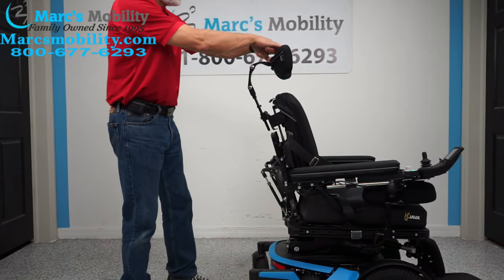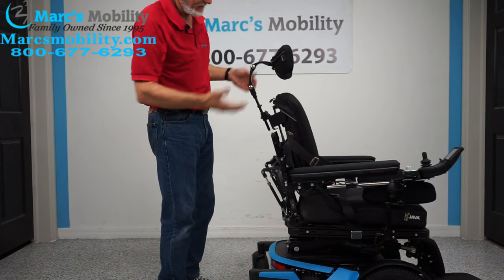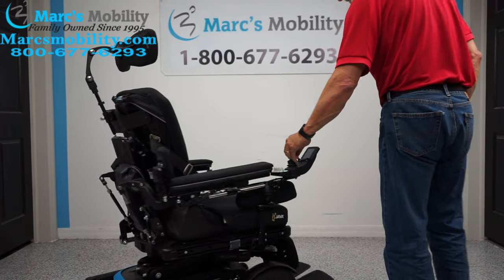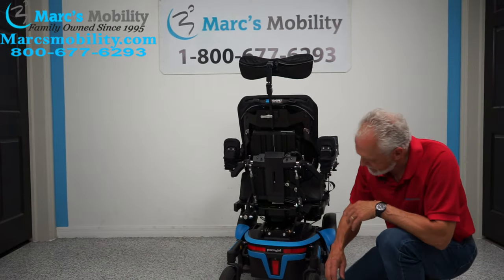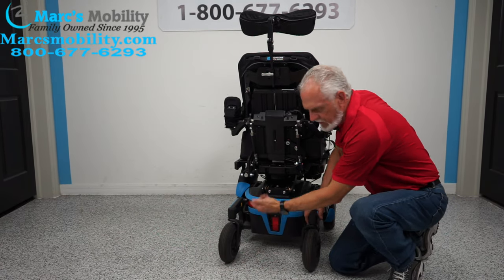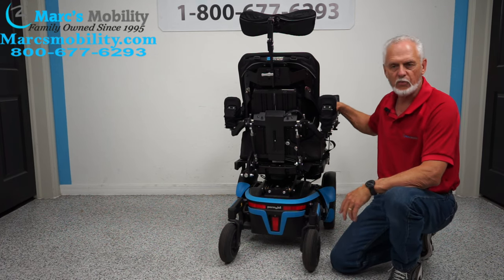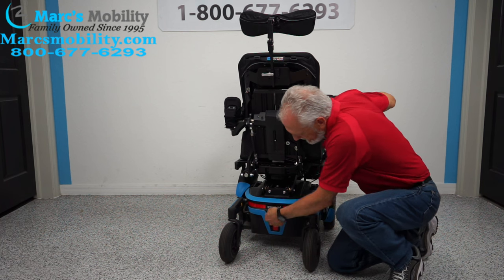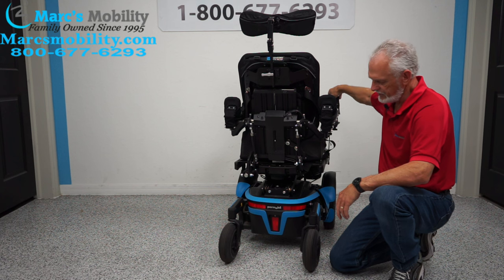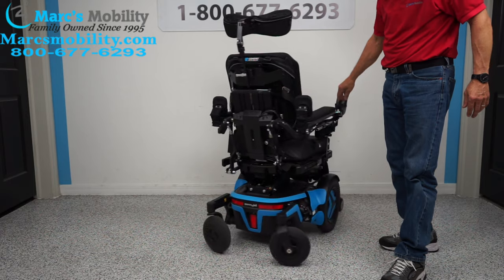The headrest is adjustable here but it's also fully adjustable forward, backward, up and down. When we ship these chairs, we turn the power off. Right in here there's a reflector — inside of here you'll see it. I just turned the power off. When you get your chair, go right here, flip the switch — there we go — and then turn your power back on up front, wait about 3 seconds, and you're back in business.